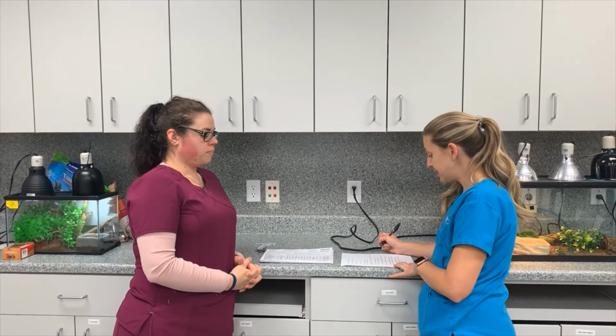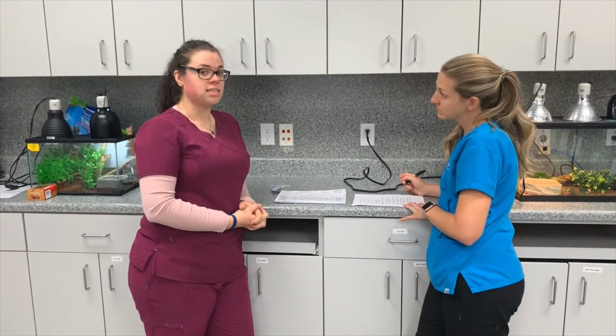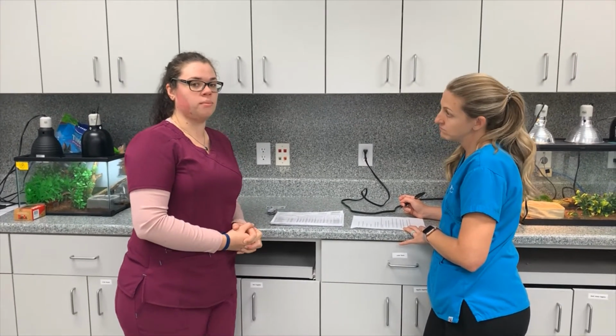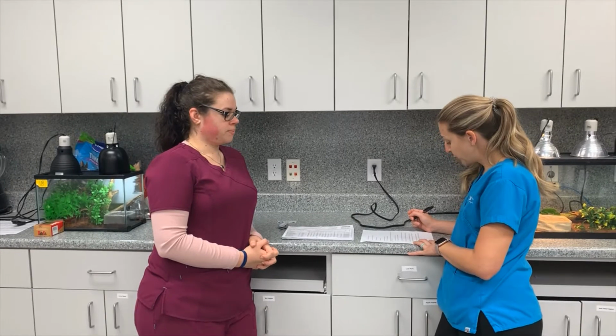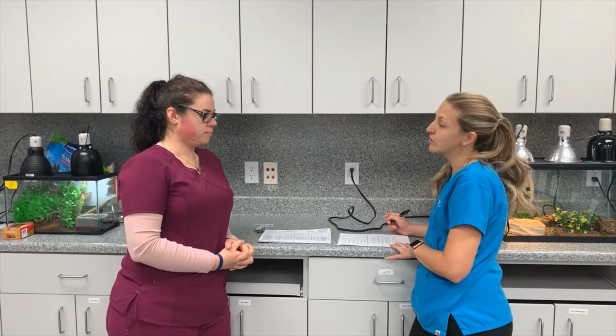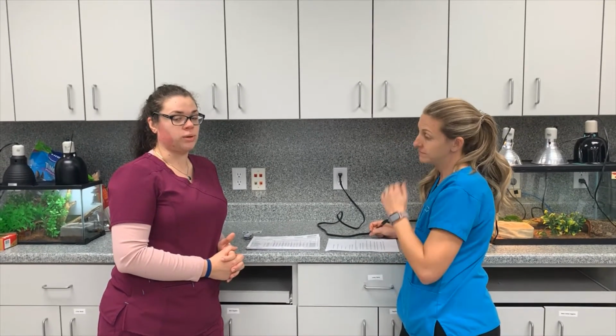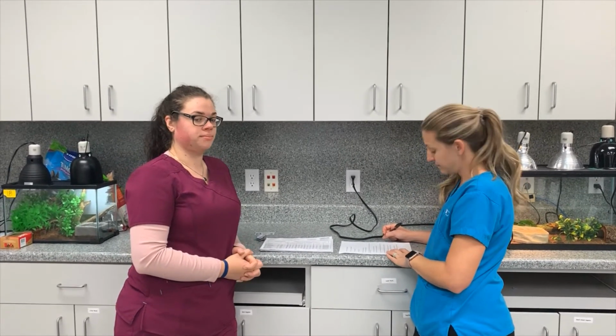Why should non-essential personnel be removed from the X-ray suite during exposure? Non-essential personnel should not be in the X-ray suite because we want to limit any person's exposure to radiation, so if they're not necessary there, then they should not be in the area. Why should we make every effort to obtain diagnostic images on the first exposure? Radiation affects animals just as much as it affects people. So the quicker we get those images, the less exposure we have to the radiation, the less we have to worry about any damage being caused.